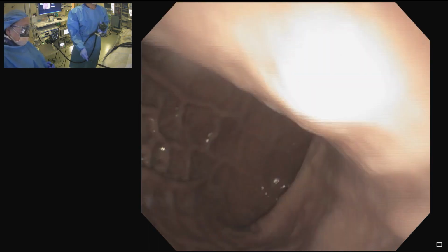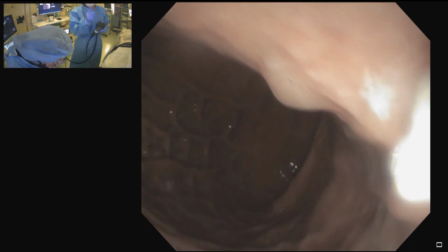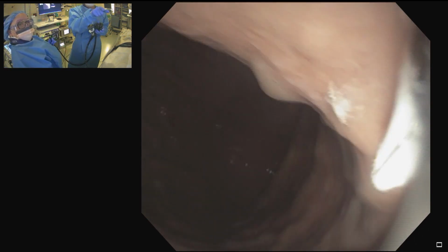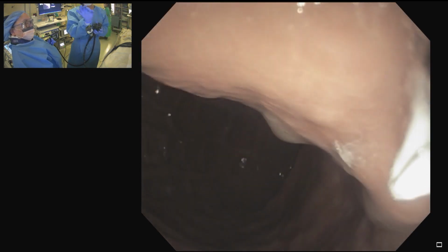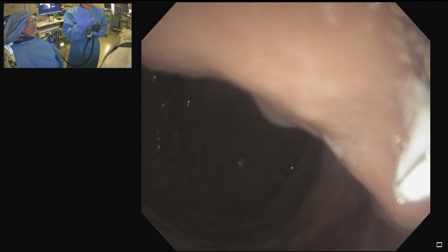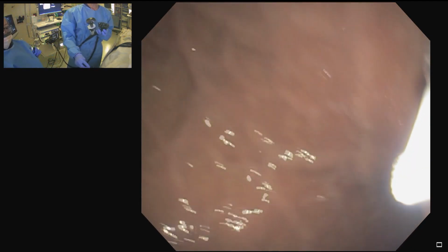All right, so I've got to pull back even further. It's got to go smooth. Now it's coming out, and now I can stop. You can actually see one of the micro wires there on the side. So these micro wires are what allow us to cut through the tissue with minimal coagulation. The surface area of those micro wires is about 3% of the total surface area of this bougie ceramic tip here.